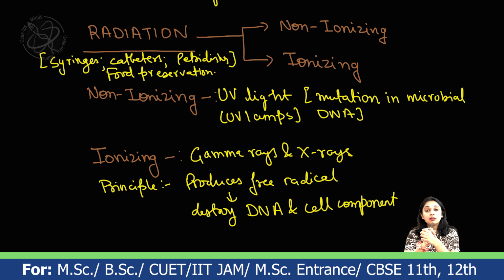This is a very important and mostly used method in day-to-day life. Not only in labs, but in hospitals, bakeries, and so many places, we use these methods to sterilize by using filtration and radiation.